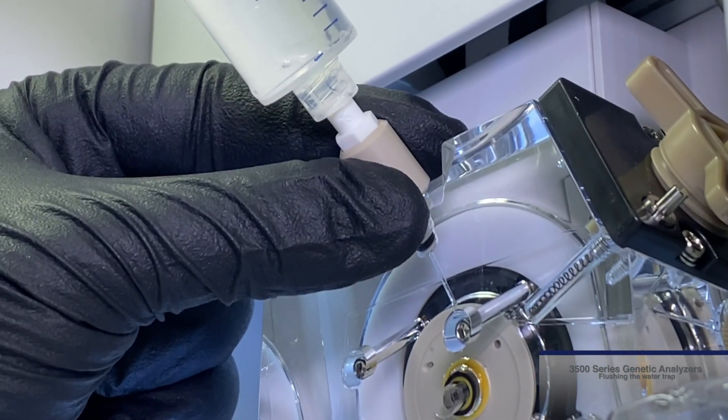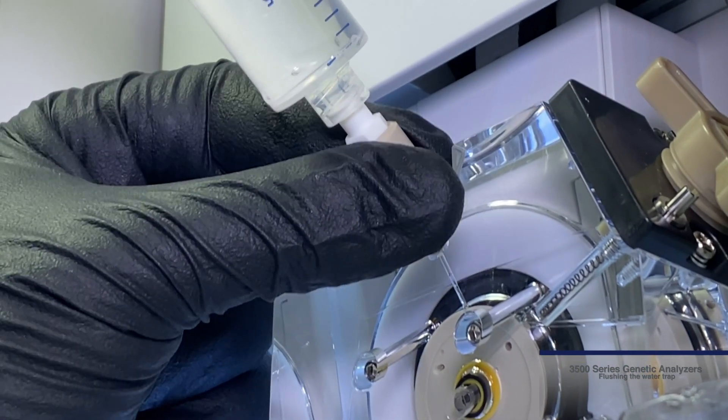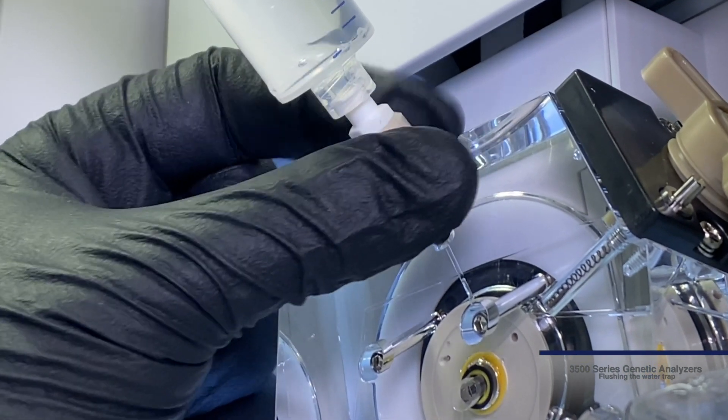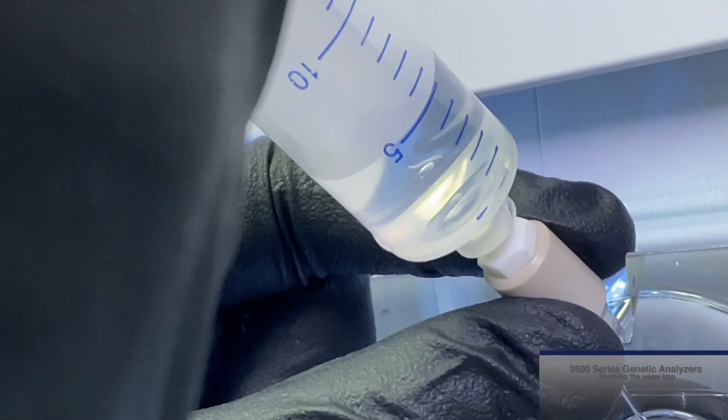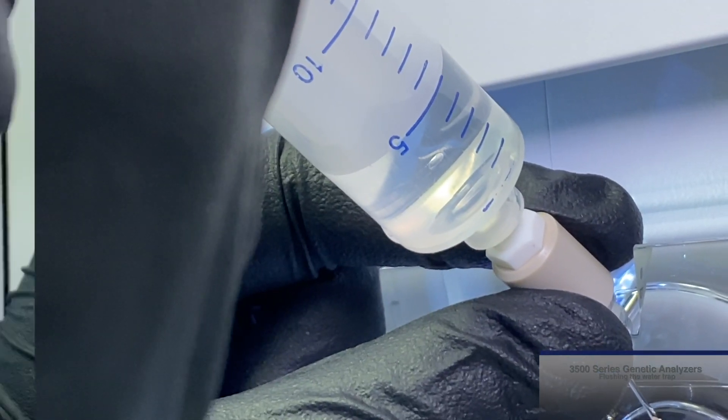Next, open the lure fitting by grasping the body of the fitting and turning counterclockwise approximately one half turn. Once this is done, depress the plunger to run 5 to 10 milliliters of water through the system.